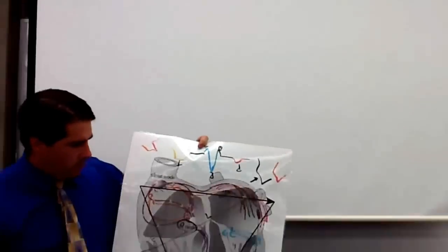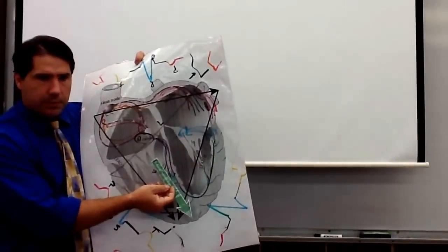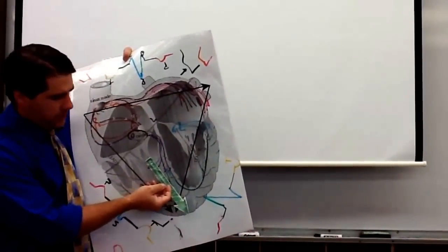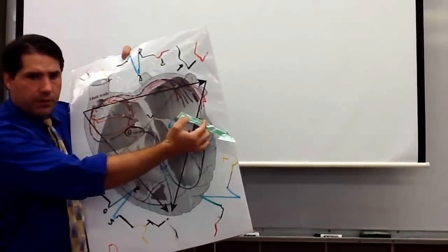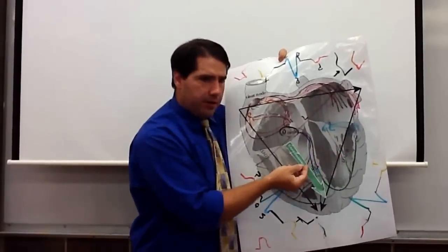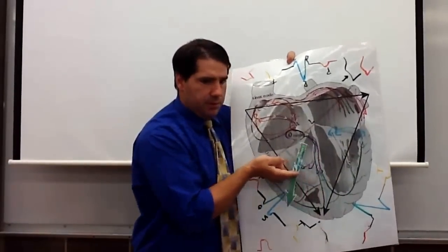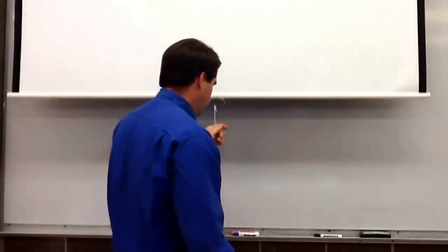Trying to get it for the camera. The first thing is essentially what you're looking at is apical depolarization. Because if you see changes in apical depolarization, it could mean that there's extra muscle growth over here, or could mean death over here. So any kind of change in muscle thickness is going to change apical depolarization. So that's essentially what we're looking at.